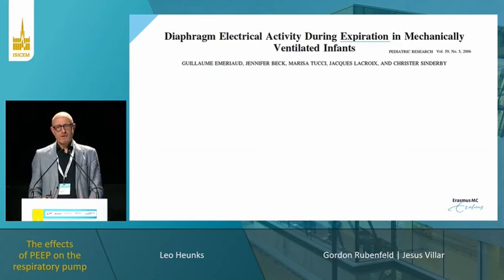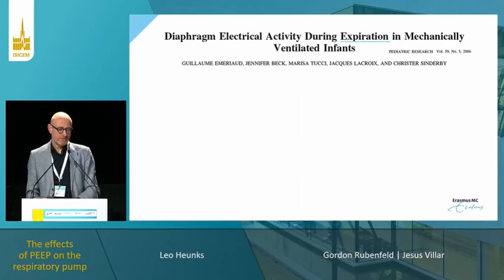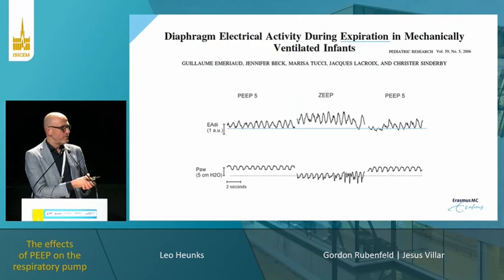Okay, so far we have been talking about the effect of PEEP on the inspiratory effort. So let's talk a little bit about the effect of PEEP during expiration. And this is a very nice study in ventilated children. Right here, this is at PEEP of 5, release of PEEP, again PEEP of 5.